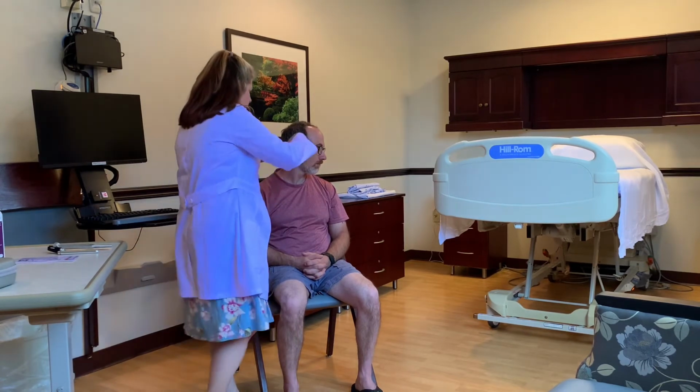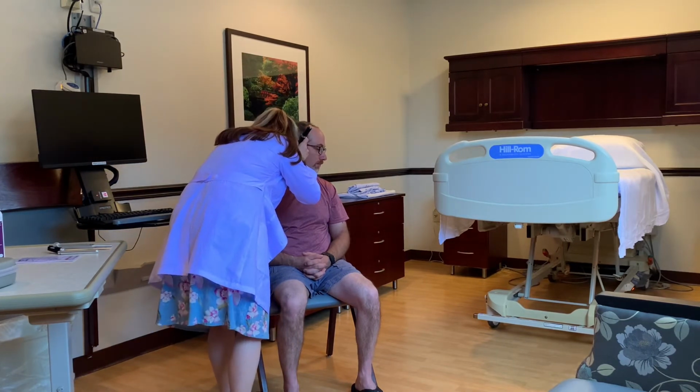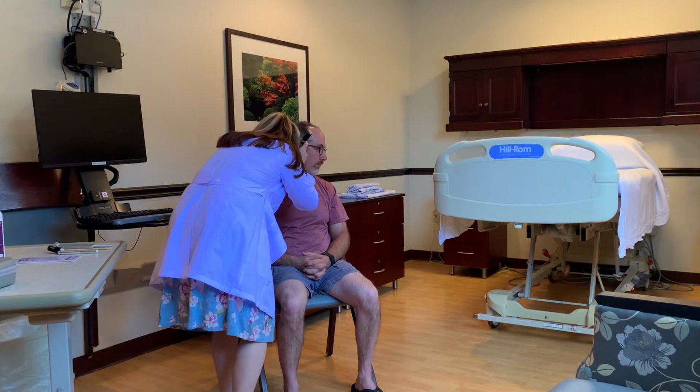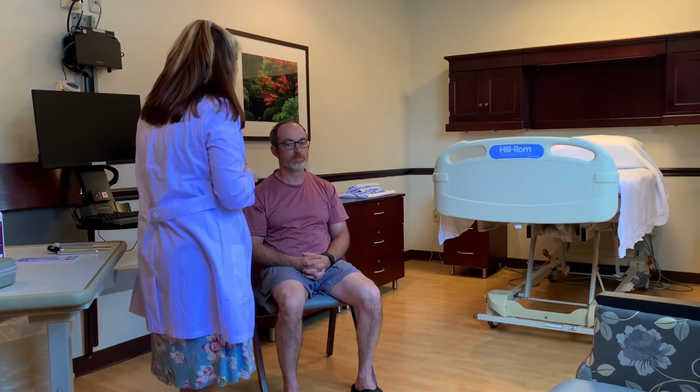There's no drainage. And then I'm going to insert my otoscope here, and I'm going to look at your tympanic membrane, which is pearly gray as it should be. I'm not seeing any exudate or erythema or edema inside the ear, and all of the bony landmarks are visible.